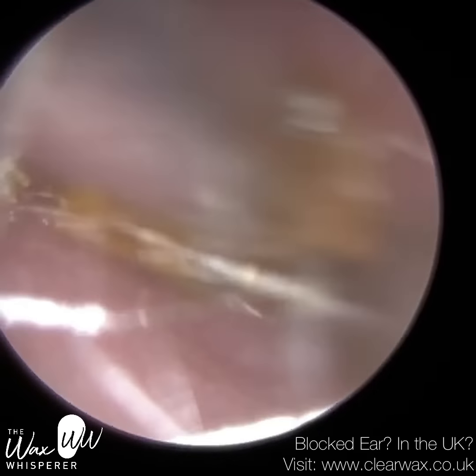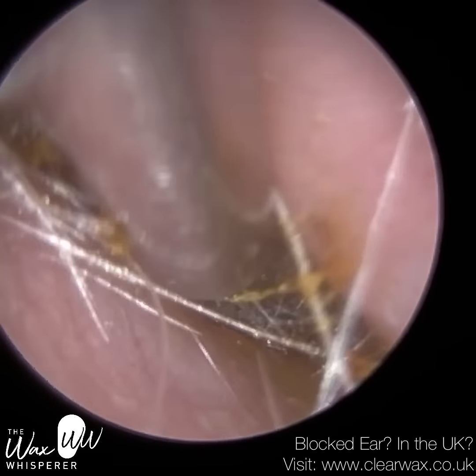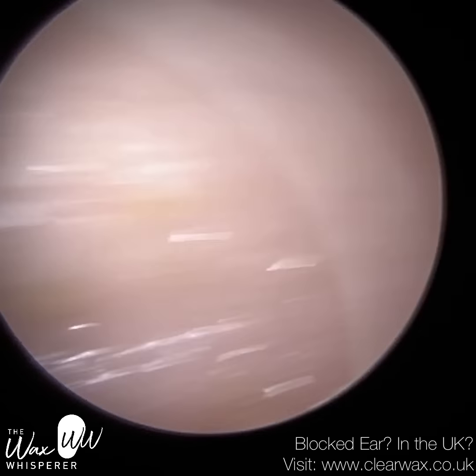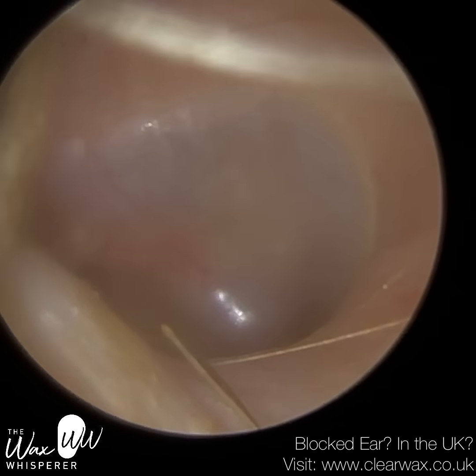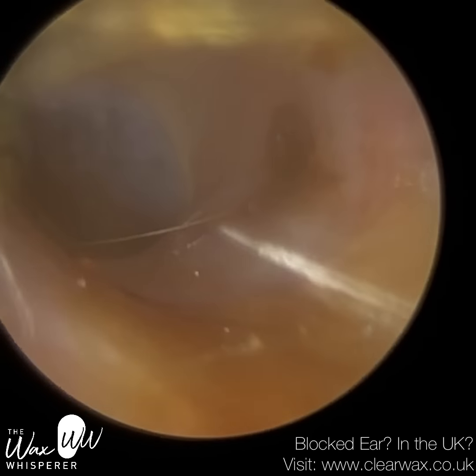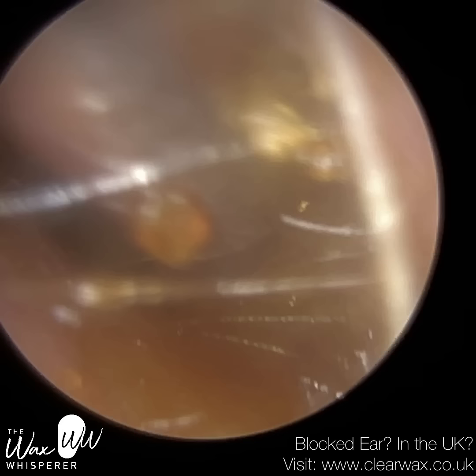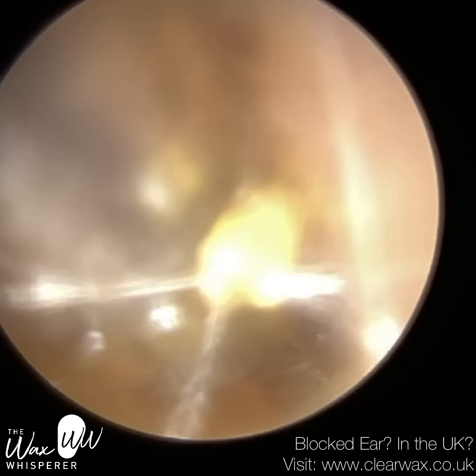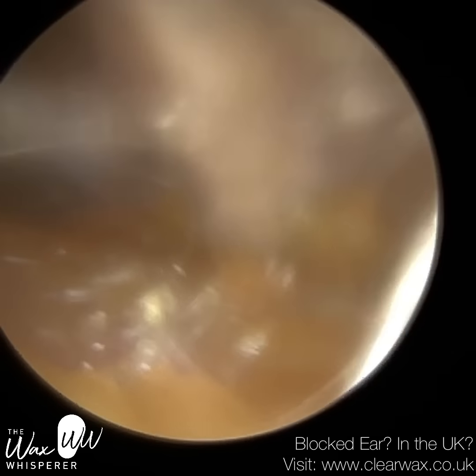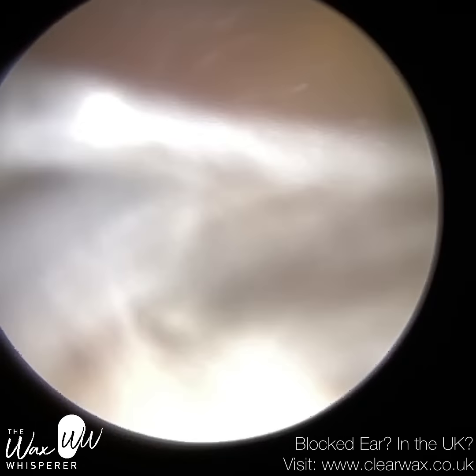I've managed to get a good suction grip and I'm just trying to tease this through. You can see that wax plug is larger than the entrance of the ear canal — as I was bringing it through, it snapped away, but that's not a problem. I'll go back in and remove the deeper part of the wax. That's the patient's eardrum now visible. I'm just going to mop up near the entrance — there's a layer of dead skin, you'll see me peel that away — and there's just a bit of wax in the midsection. It's not significant; we could leave that, but whilst the patient's here I decided to get that out for them. We know we're near the entrance because of all the hairs.